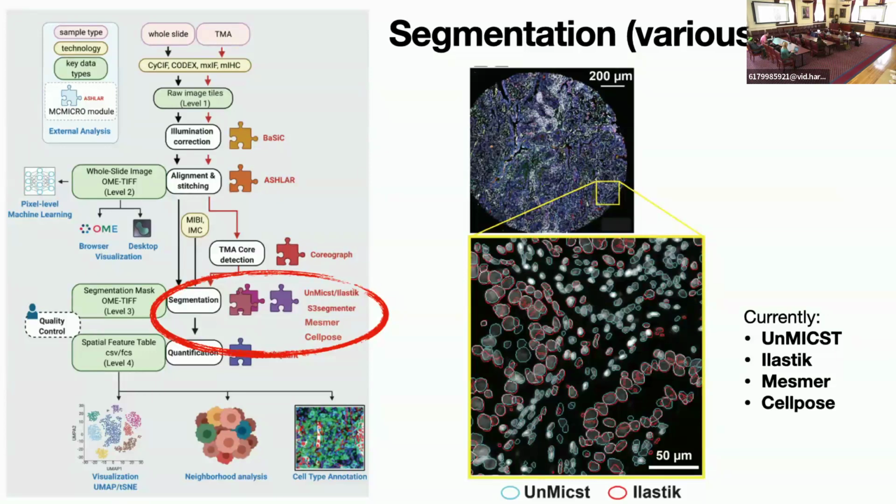Gotcha. Yeah. One of the strengths, for example, with Ilastik is they have a really easy desktop application workflow for training on your own samples. So a lot of people that have challenging tissues, we've found they'll take Ilastik and they'll sit outlining some cells for an afternoon and get pretty good results out of that. Whereas training some of these other models you need a lot more setup and infrastructure to get it going. And do you have experience with Segment Anything for microscopy, Sam? We took one quick shot at it when it was first published and didn't get good results, but I've seen other groups have better results with it since then. So it's something we do want to look into.